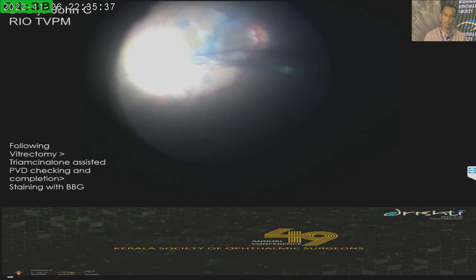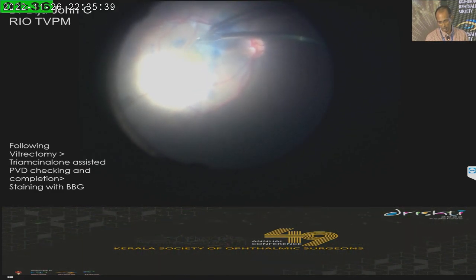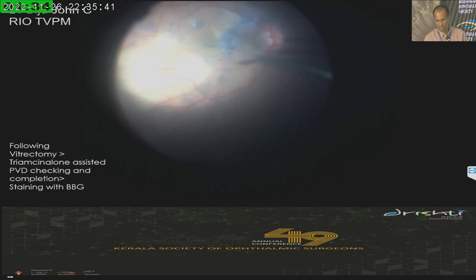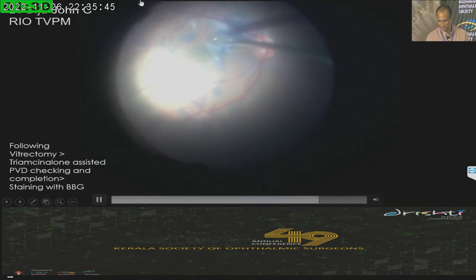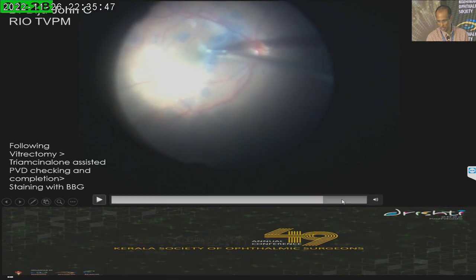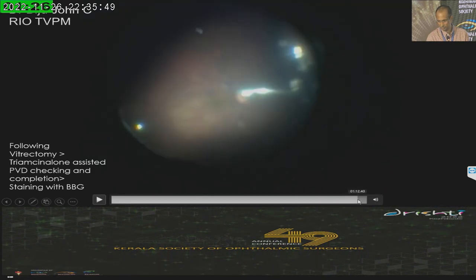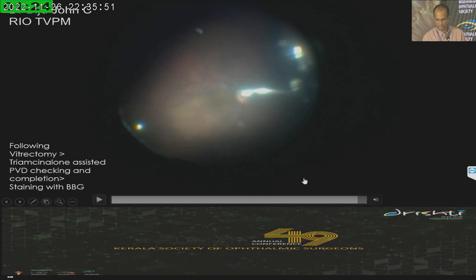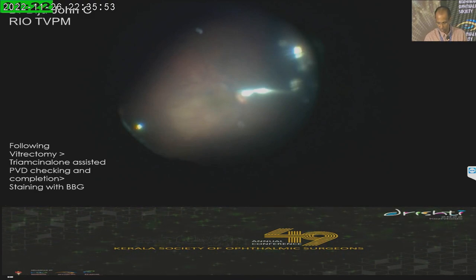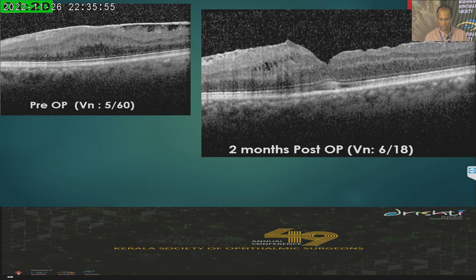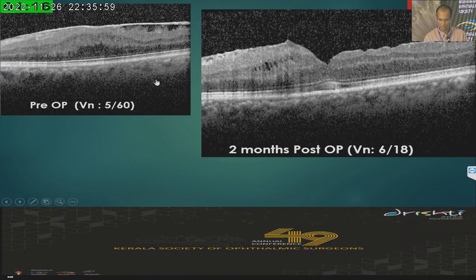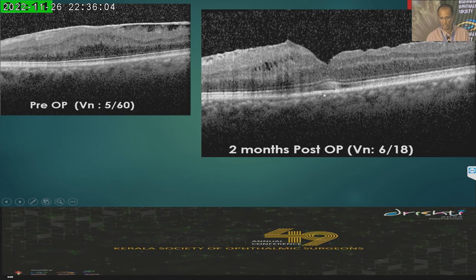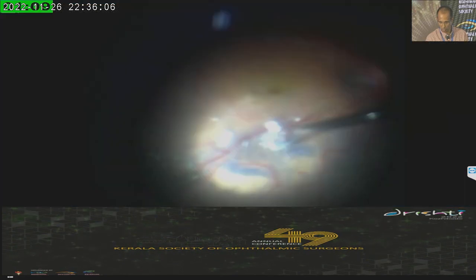I may not always get everything out, but I think I'm getting most of the ILM. After this, it is followed by fluid-air exchange. Here is the preoperative OCT and the postoperative picture at two months — there is a definite improvement and the vision has improved significantly.